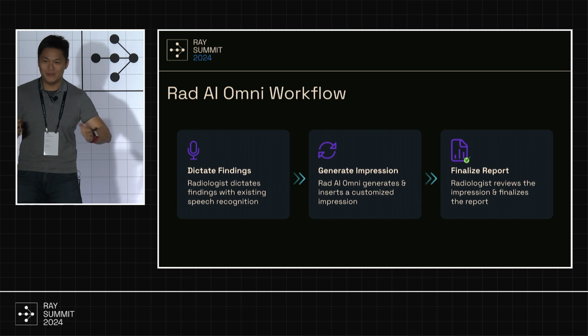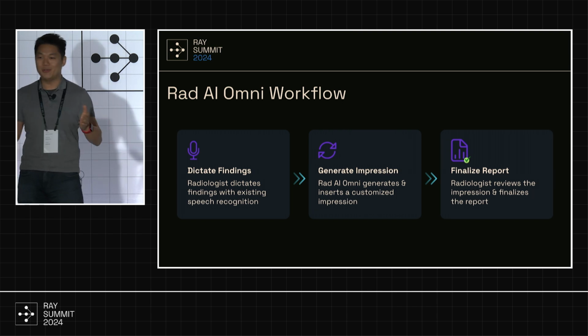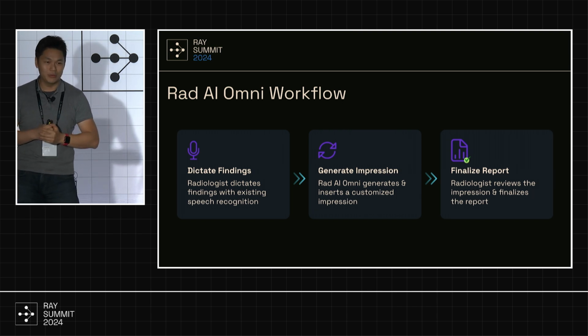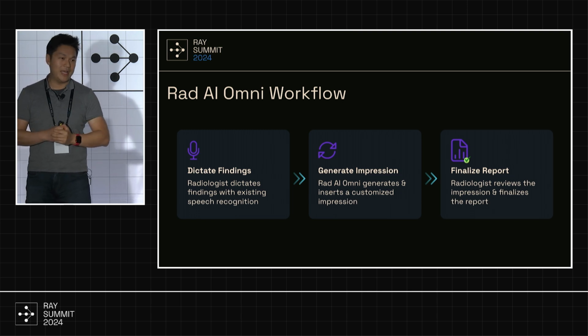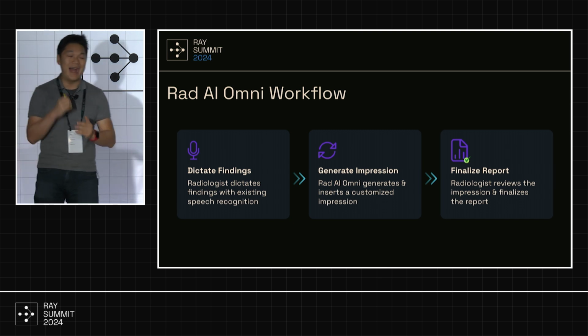Most of you are probably engineers here. You probably don't want to read through the entire document. You go to Stack Overflow, you read the TLDR, and you move on with your life. Maybe you know how it works under the hood, maybe you don't. If you have a lot of work, if you're behind on deadline, you just want to move on. Most doctors only look at the impression section, and that's why it's important to make sure this part is automated with high quality.